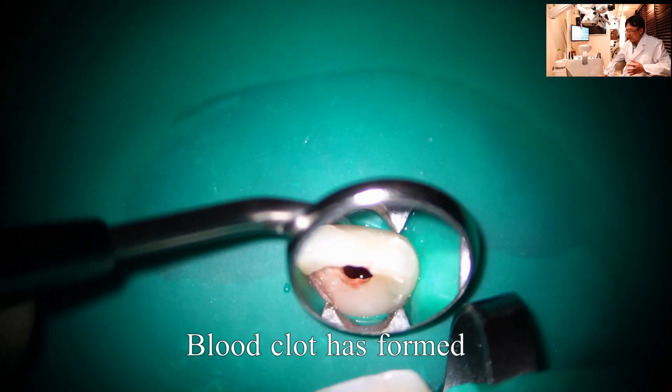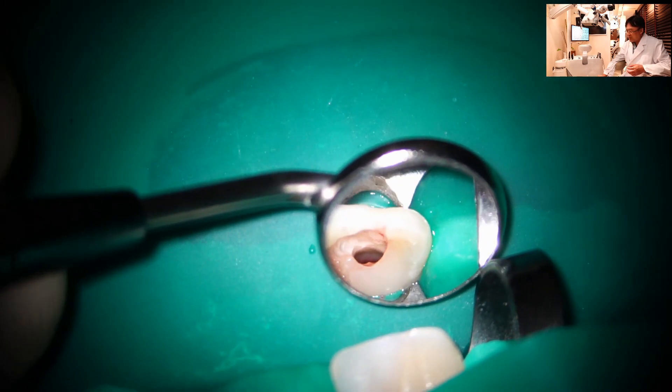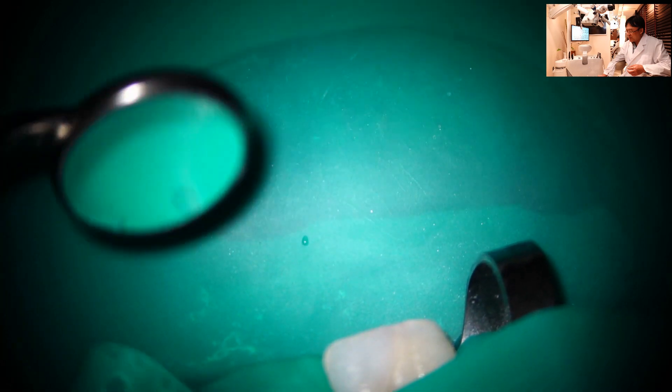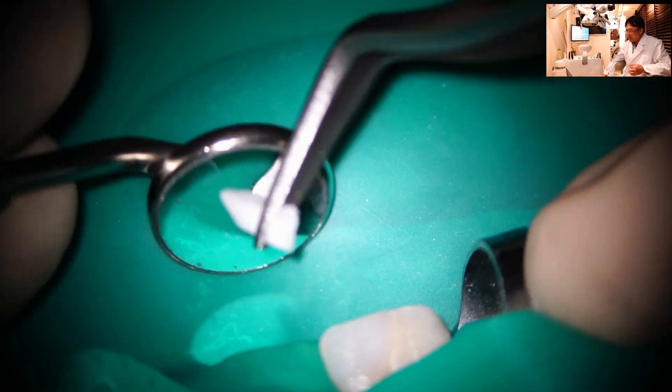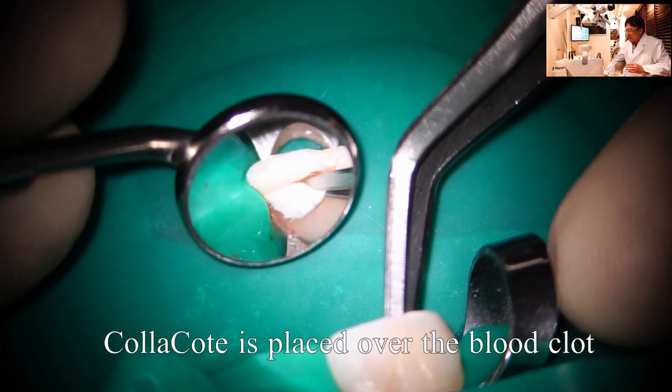Now, a blood clot has formed. Then I'm placing CollaCote over the blood clot.